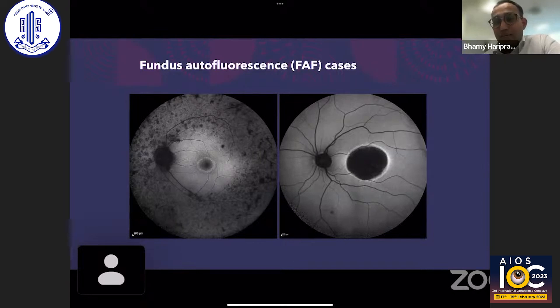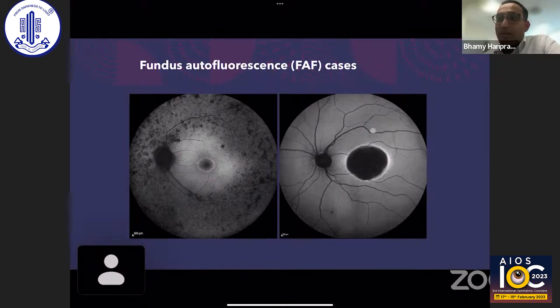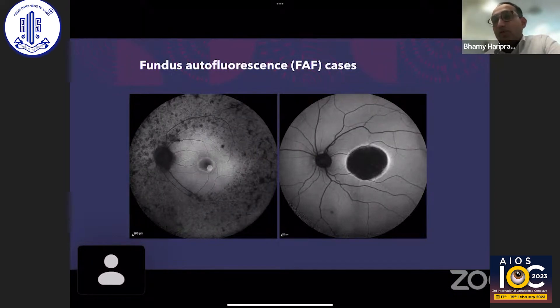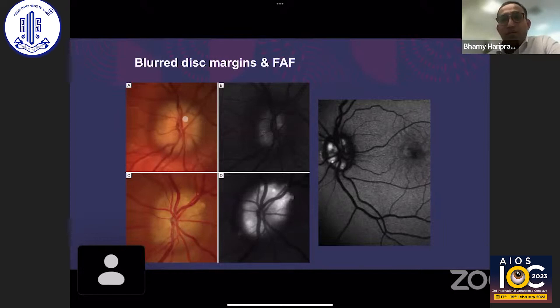The hyperautofluorescent ring marks the junction of viable and non-viable retina, but the viable retina can be either inside or outside the ring depending on the condition. In this macular dystrophy, probably North Carolina macular dystrophy, the viable retina is outside the ring, whereas in retinitis pigmentosa the viable retina is inside the ring. Fundus autofluorescence is also helpful for visualizing drusen, including buried drusen and superficial drusen.